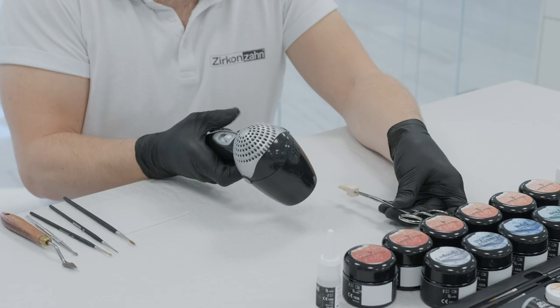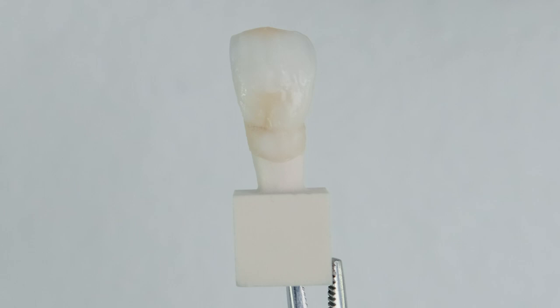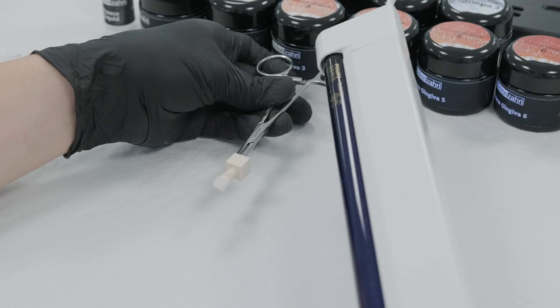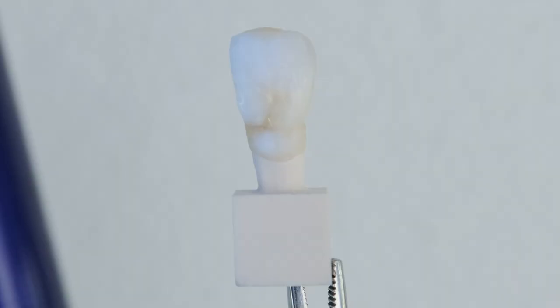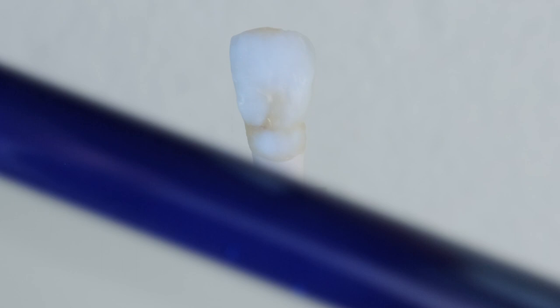We suggest to dry the fresco enamel pastes with a hairdryer in order to increase their modeling properties and better work on the structure. To check if the fluorescent paste has been uniformly applied, we recommend putting the structure under a UV lamp before the final firing.